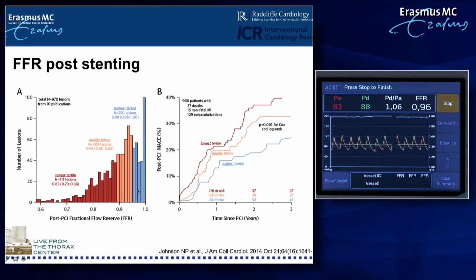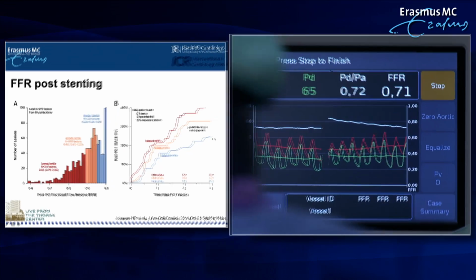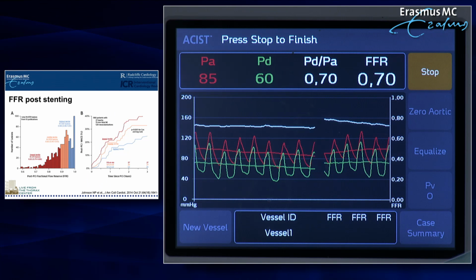These are two very different situations, and we have some preliminary data showing that the long-term results after stenting are really associated with the post-stenting FFR.